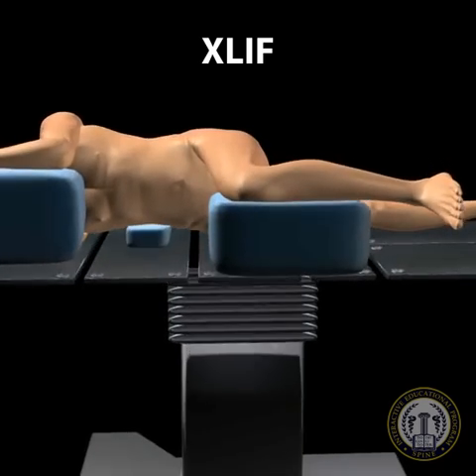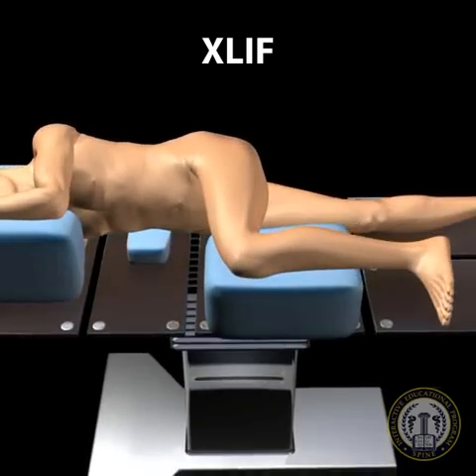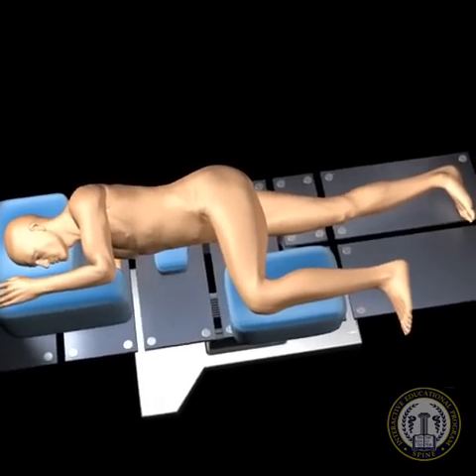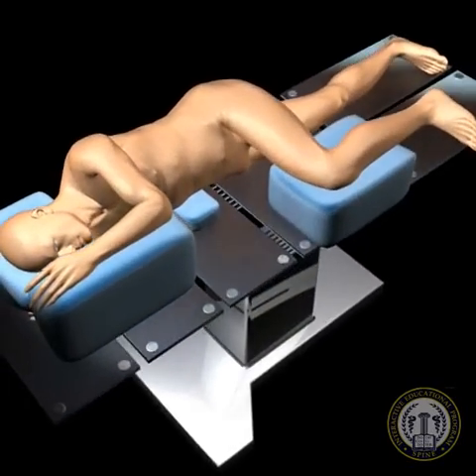The positioning for extreme lateral interbody fusion, XLIF, is a lateral decubitus position. It is important that a radiographic compatible operative table be used for this procedure.